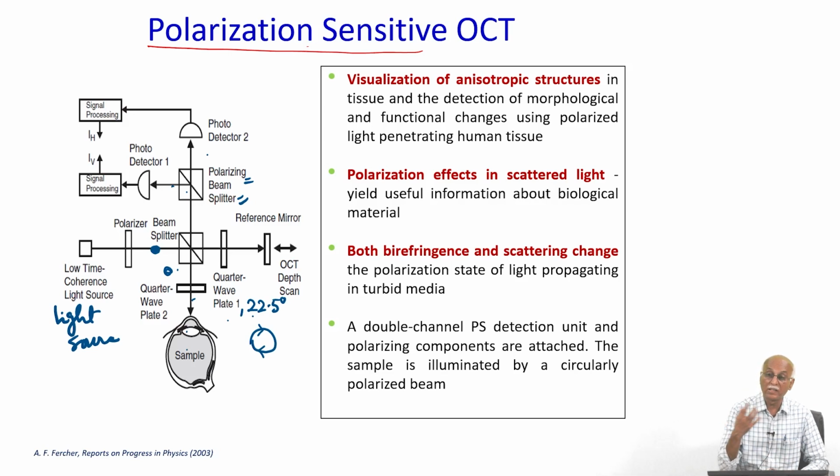That polarization information may be useful to characterize some tissues or to identify certain characteristics. Hence, PSOCT has evolved. It is useful not only in biomedical but also in various other applications, such as mechanical or electronic device characterization.